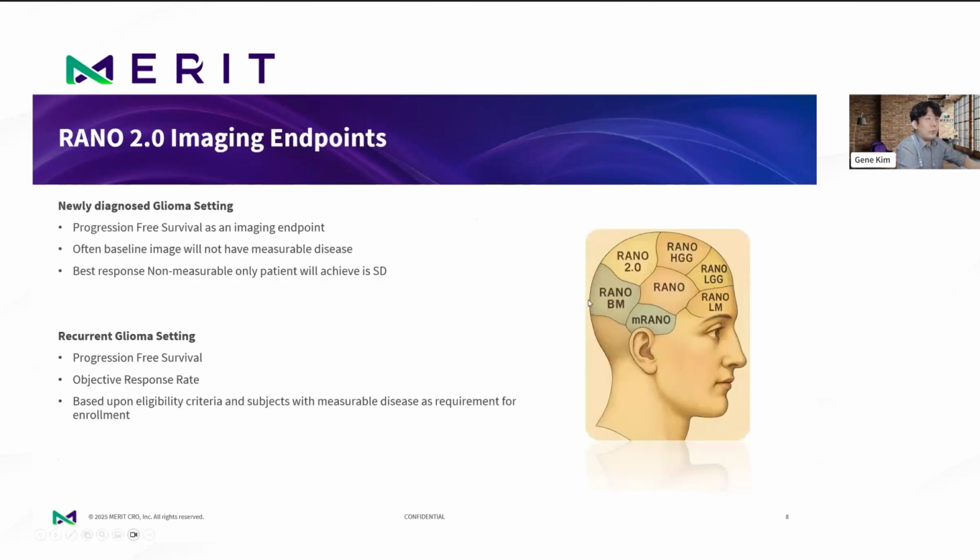Okay, before we jump into the RANO 2.0 changes and updates, I just wanted to review really quickly some basic information about the imaging endpoints for CNS tumors, which are either in newly diagnosed glioma settings or recurrent glioma settings. So often in newly diagnosed glioma settings, progression-free survival is an imaging endpoint to be used.